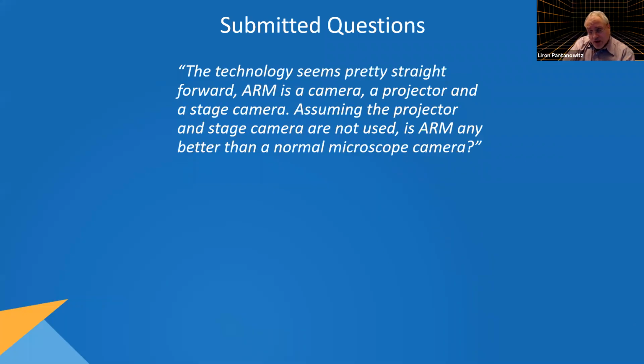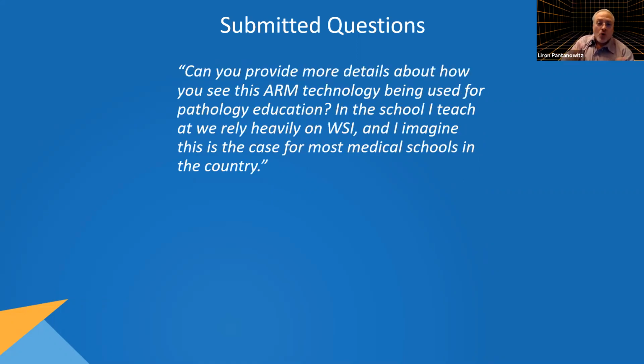I actually haven't thought about that because I haven't used it yet, but it definitely can. So two examples would be, number one, if you are at a medical school where you could not invest in whole slide imaging technology, or even if you have it, you could still have your teacher up front with your learners, and you could broadcast from one microscope so everyone could see what's going on. If you don't have someone who could teach you, at least if you have a microscope, many schools around the world still have microscopes, you could introduce some self-tutoring, AI, etc.